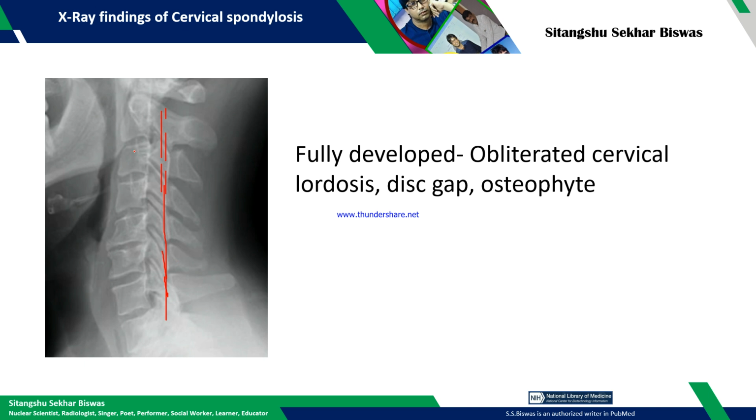And you see there is a non-uniform disc gap, this gap, this gap, this gap, these are not uniform.